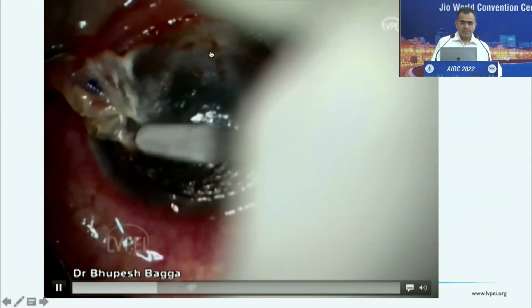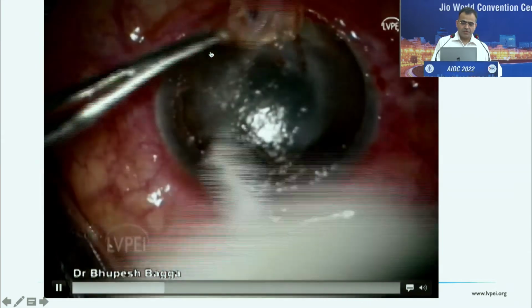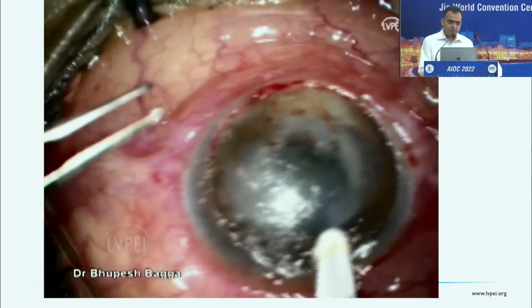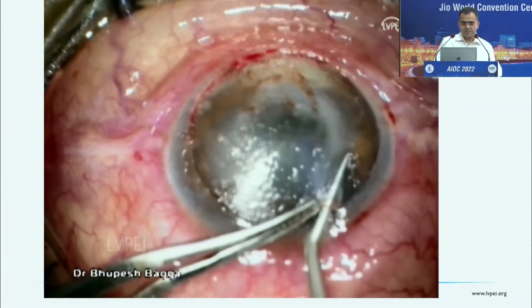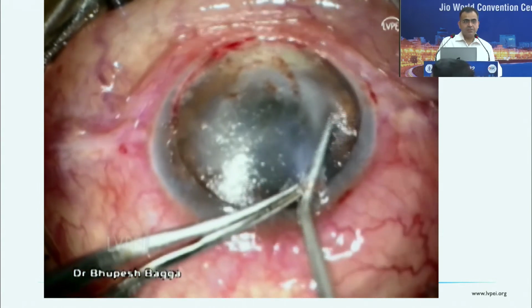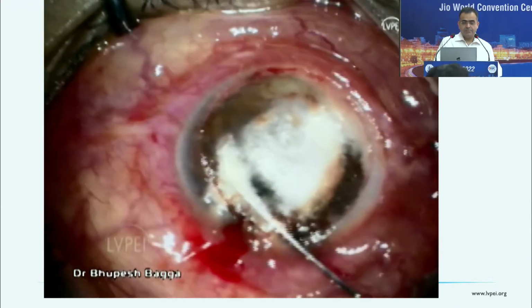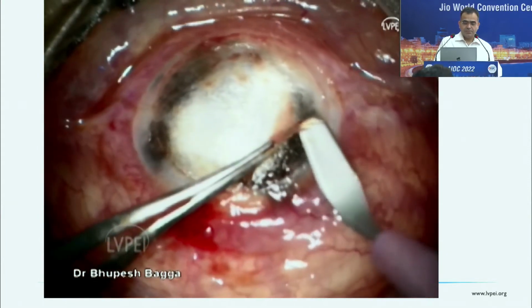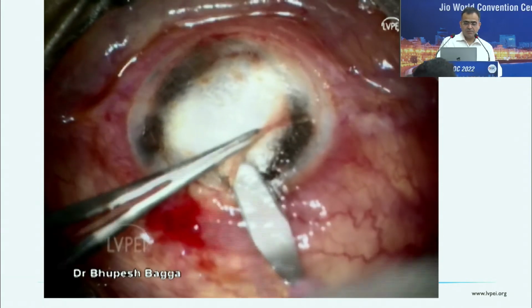Removal of the anterior lamellar is a very important step in the management of infectious keratitis when you're performing DALK. In normal cases we can do it without removal of the anterior stroma as well, but in these cases we need to perform it after removal of the anterior stroma. And then, as a routine procedure as described before, we perform a big bubble technique in all cases, and try to make a big bubble if it is forming.